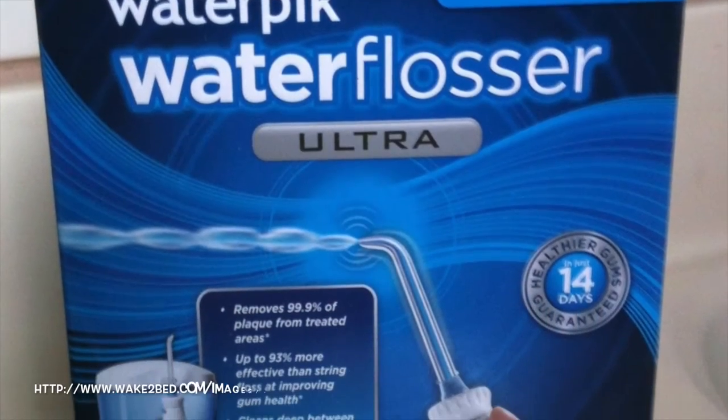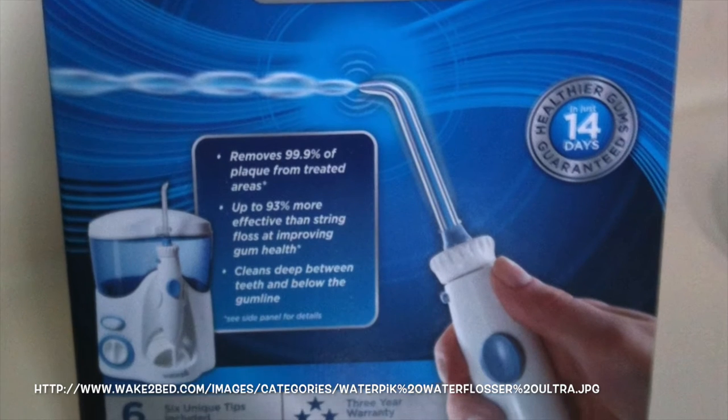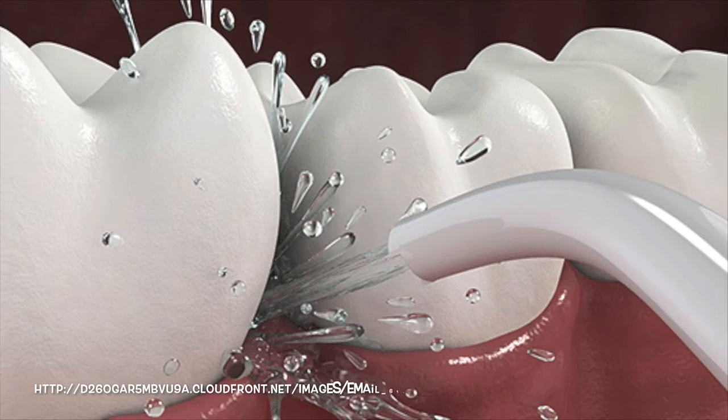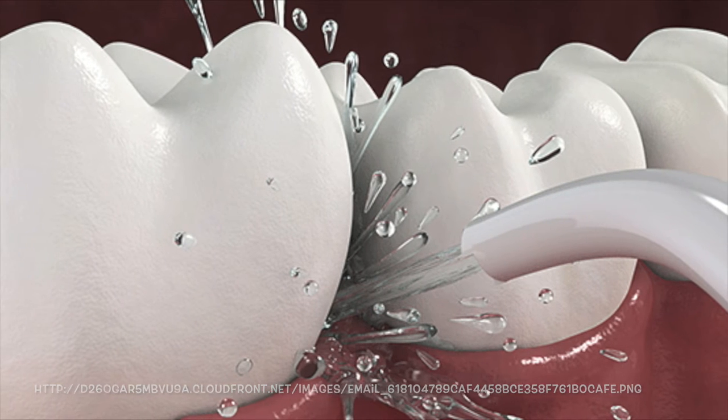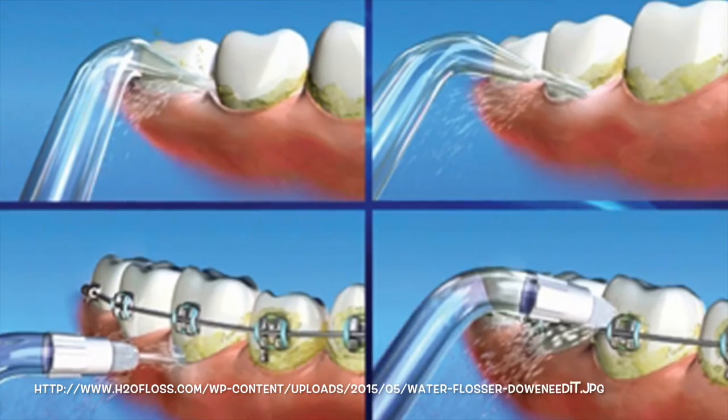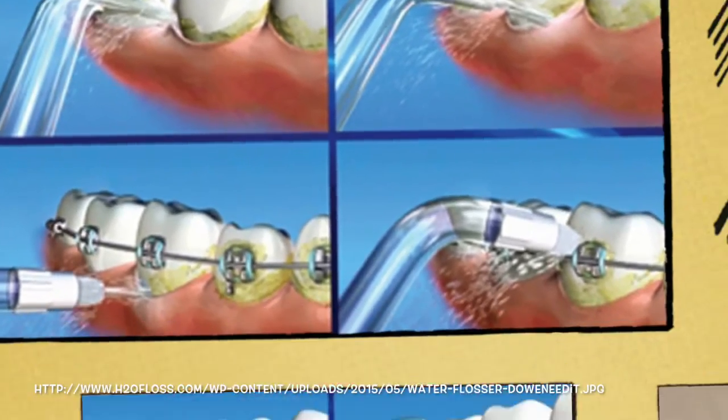Water floss. Uses high pressure water to blast plaque out of the interproximal spaces. Aim towards the gums. Useful for blasting out food particles around hard to reach areas and around braces, crowns, implants, and sensitive gums.